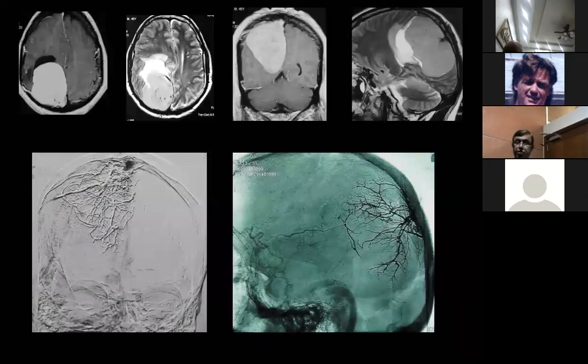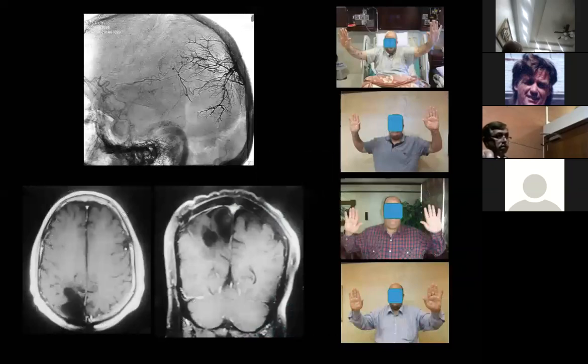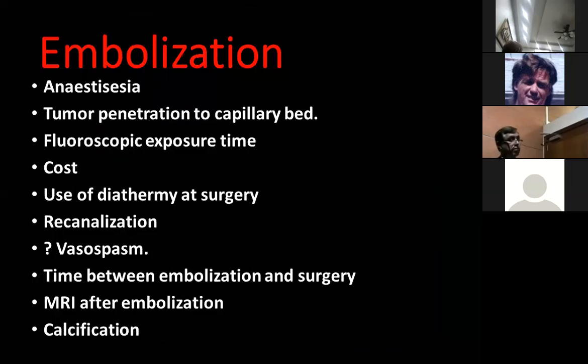And this is one of my patients, a giant parasagittal meningioma causing severe edema, very vascular. We embolized. I think it was done by you, isn't it? This is the radiologist. And you can see the Onyx inside the vessels. There it is. We excised the tumor completely without any complication, and there's the man. That was done a few years ago.